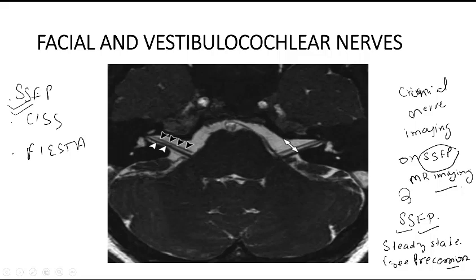In this video I'll be discussing basically these six nerves: the facial nerve, vestibulocochlear nerve, glossopharyngeal nerve, which is the 9th nerve, vagus nerve, which is the 10th nerve, spinal accessory nerve, which is the 11th nerve, and the hypoglossal nerve. I'll be telling you how these nerves appear on this Fiesta or SSFP or CISS MR imaging sequences.